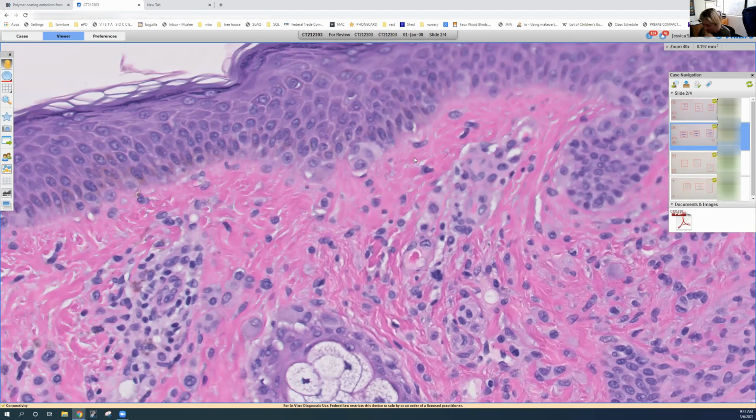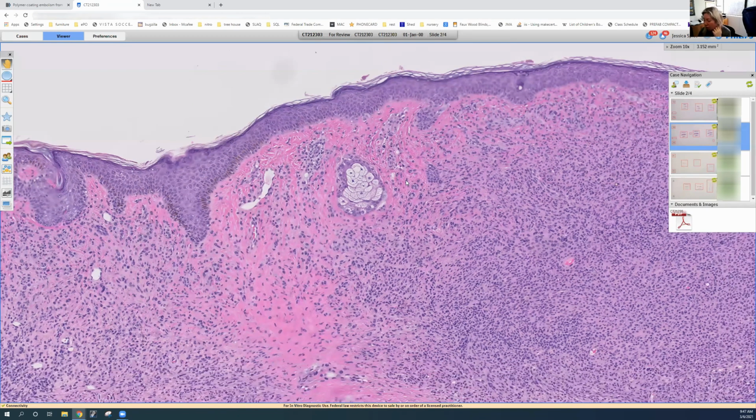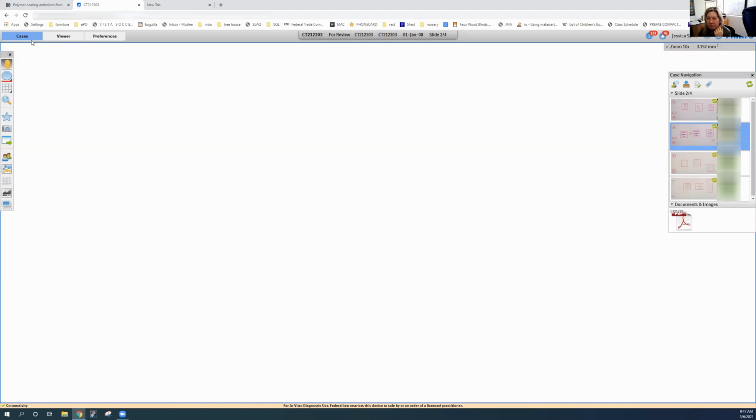And I would just say also there's very little known about the natural history of BAP1 inactivated melanocytic tumors or the phenotypic or histologic features of the primary cutaneous melanomas in this cohort, in the patients with the germline mutations. And despite the high lesion counts in these patients with BAP1 inactivated melanocytic tumors, there's a very low rate of cutaneous melanoma. So we're still working out why that is. Really fascinating. All right, let's go on to the next case.